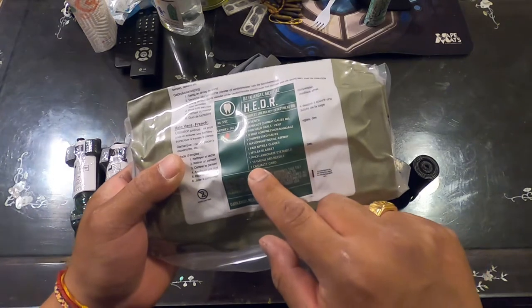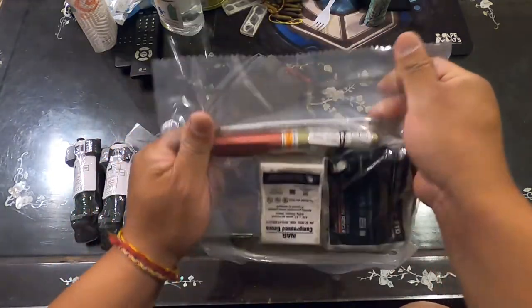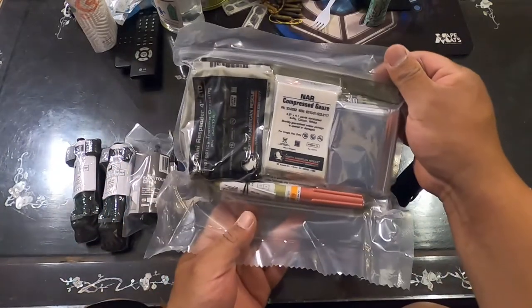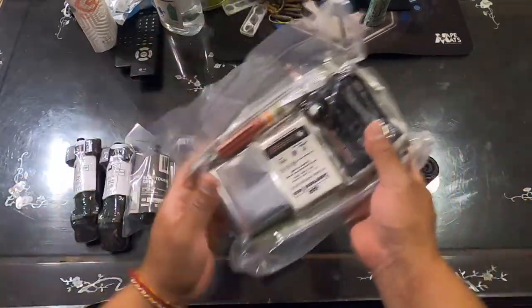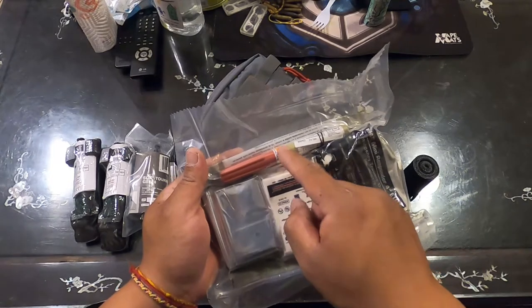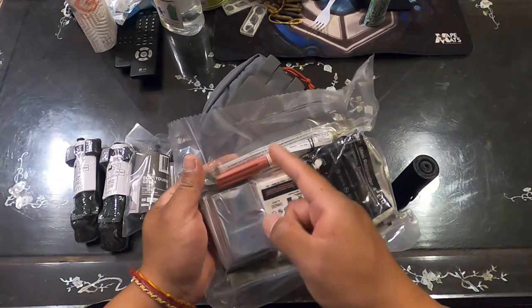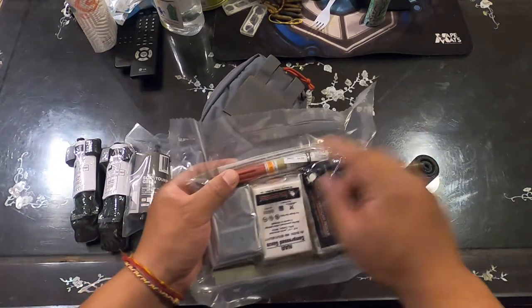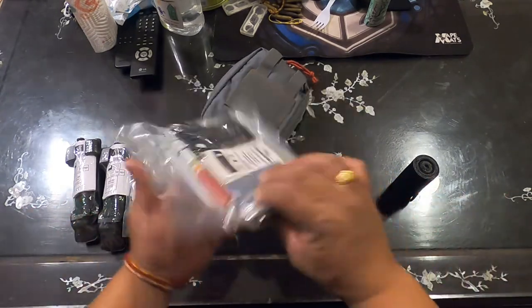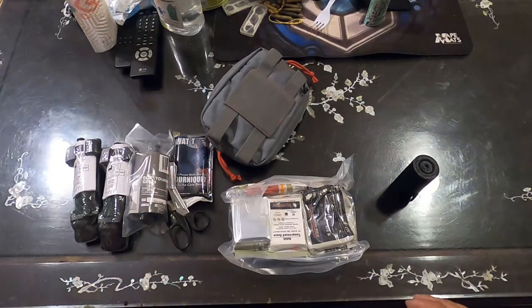Also included: one pair of nitrile gloves, a mylar blanket, a polycarbonate eye shield, a 14-gauge ARS needle, and a casualty card. This is what it looks like all compressed and ready to go. The needle is very hard to come by — not a lot of companies are willing to sell it alone. It's a decompression needle, very useful. I'm going to leave the bag sealed since I'm keeping this in my car.